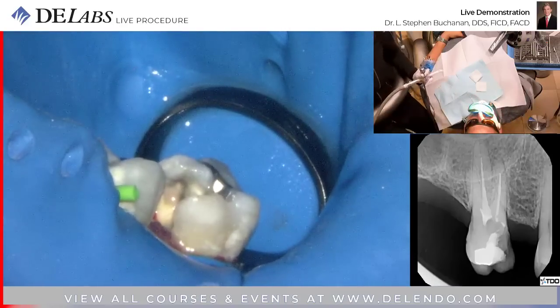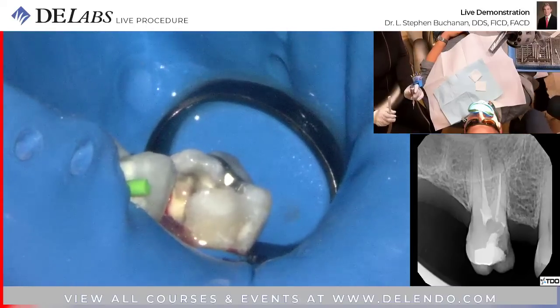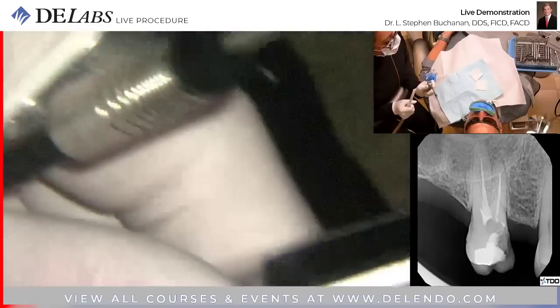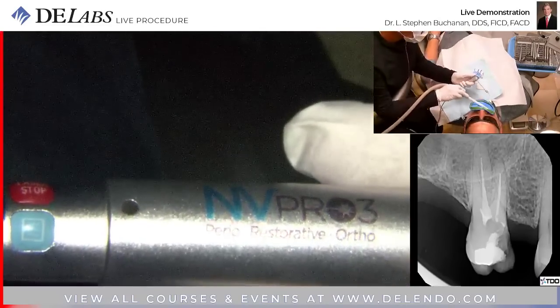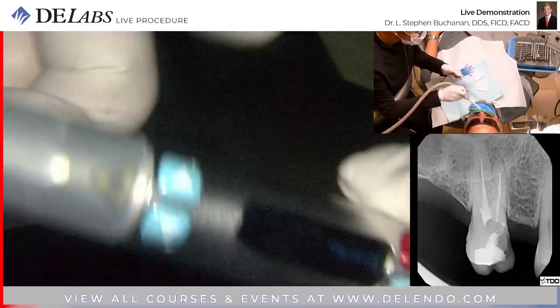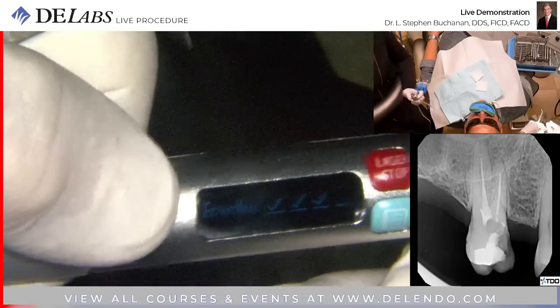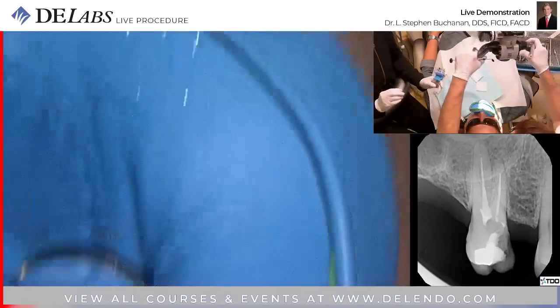Let's use that. Is the laser set up? Pardon? Yeah. Okay. Let me show you one of my favorite little toys. This is a diode laser from Denmat. Where's the picture? There we go. Okay, and it's driven by the foot pedal. It's got a Bluetooth foot pedal.